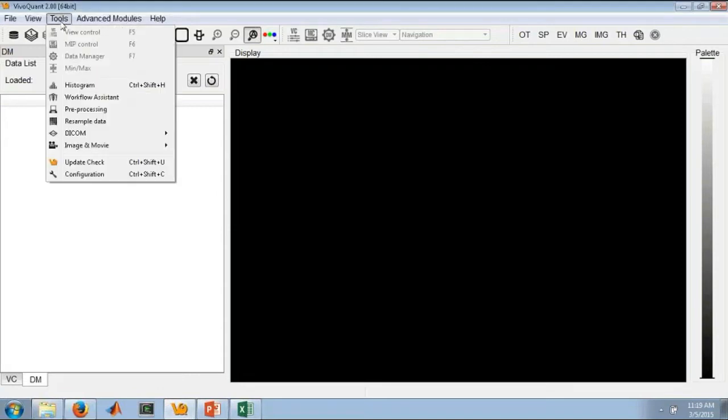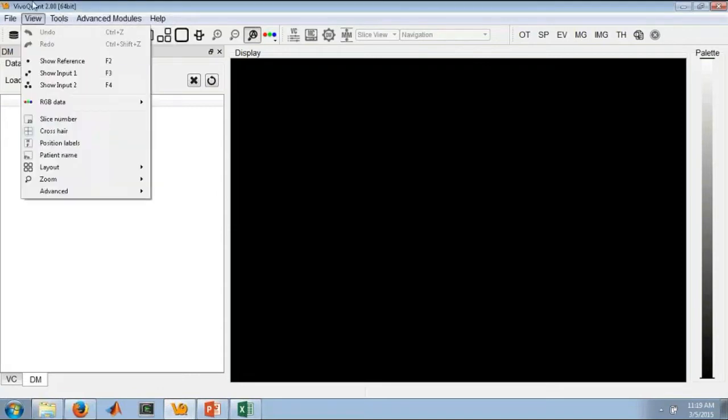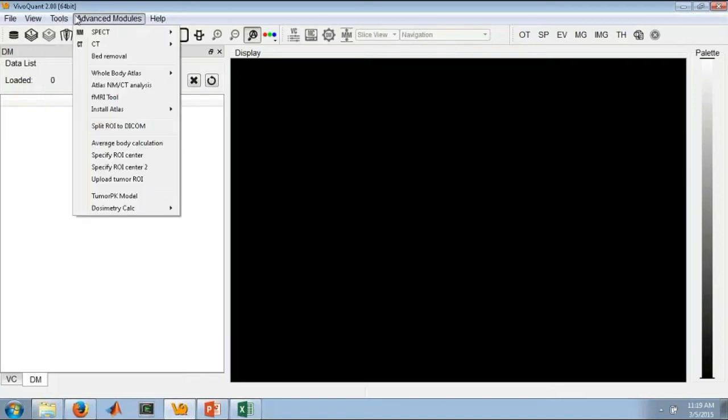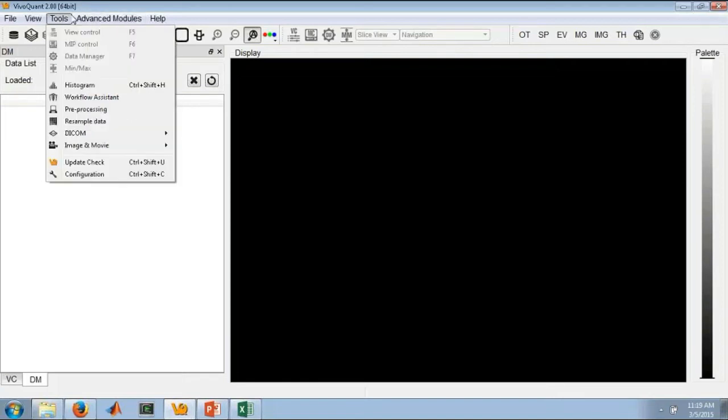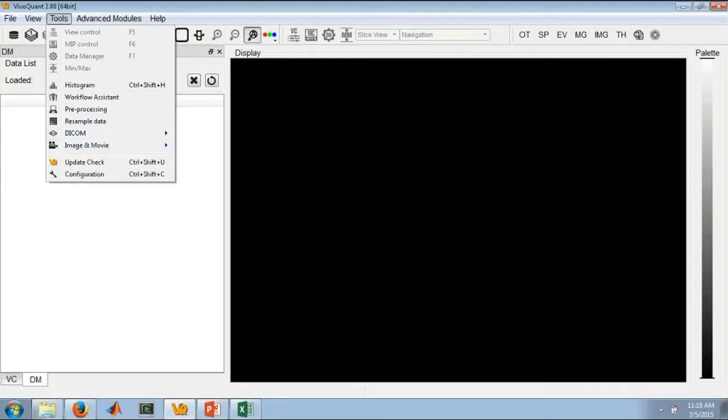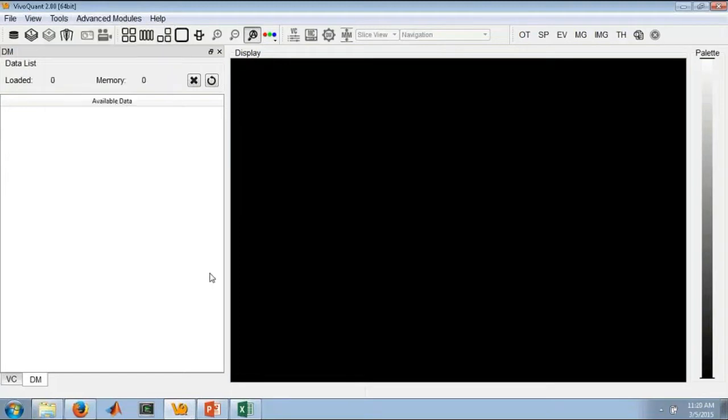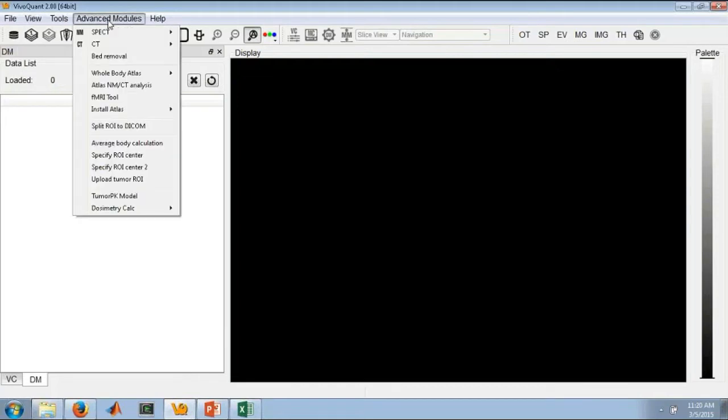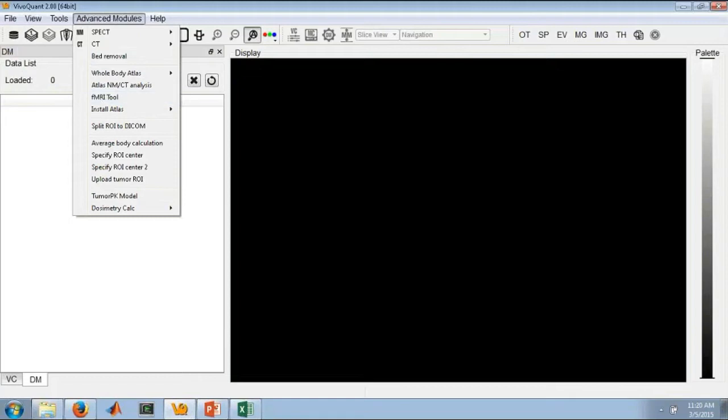We've trimmed down the Tools menu to really just be the main tools that you need to use on your day-to-day basis, whether that's preprocessing data, resampling data, editing your DICOM headers, making images and movies. Really the main focus of the software. Then we also have added our advanced modules tool. This drop-down includes your plug-in modules, your advanced SPECT and CT analysis tools. Things that you may not need to use on a day-to-day basis, but are still very useful within the software.